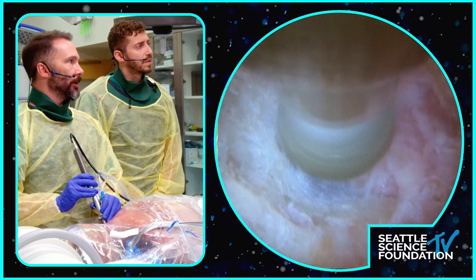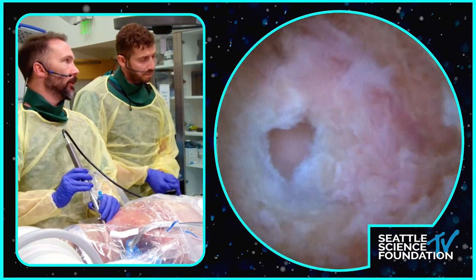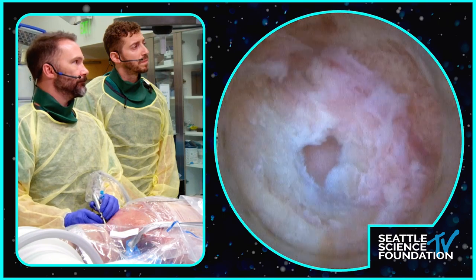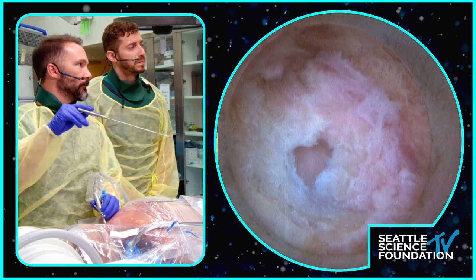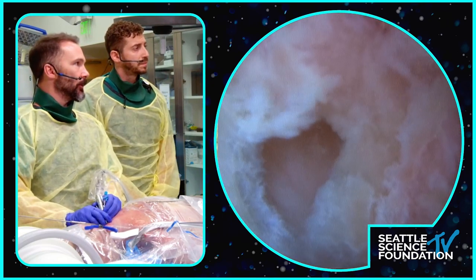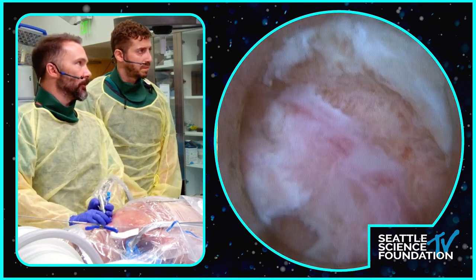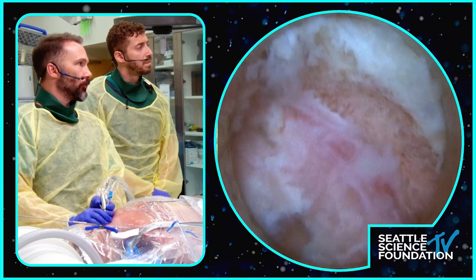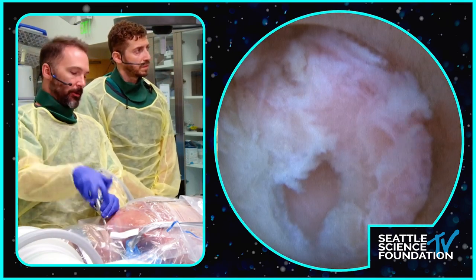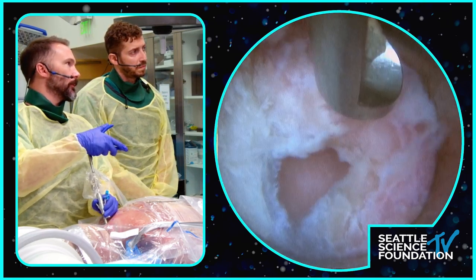I think patients, especially young active patients, really appreciate having something available that doesn't involve fusion. I still do a lot of ACDFs, but I do many fewer as a result of incorporating this into my practice. Lynn, show the audience the difference in bone thickness here — lateral versus medial. You can see we're getting to soft tissue down there, and it's going to be a progression as you get more and more lateral. Let me just orient everyone.